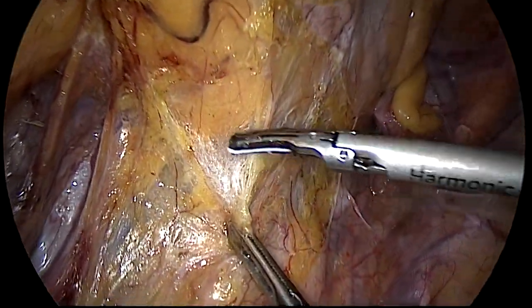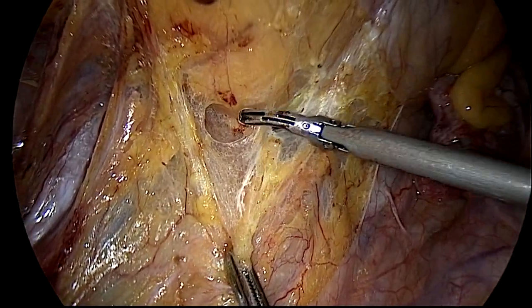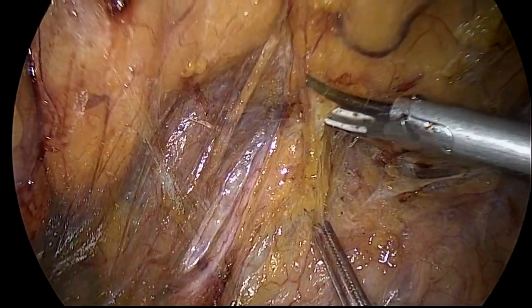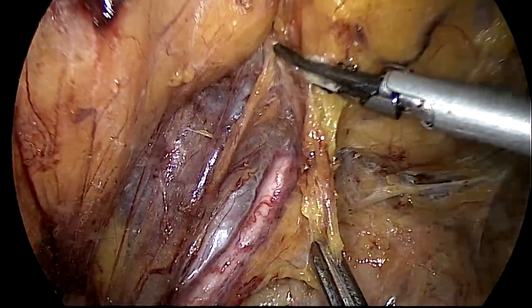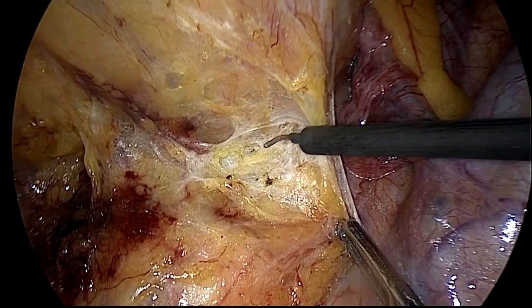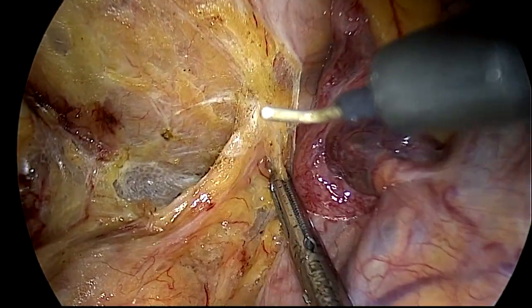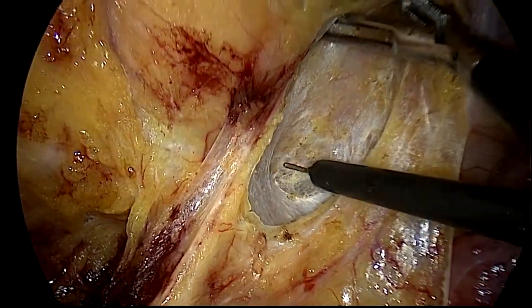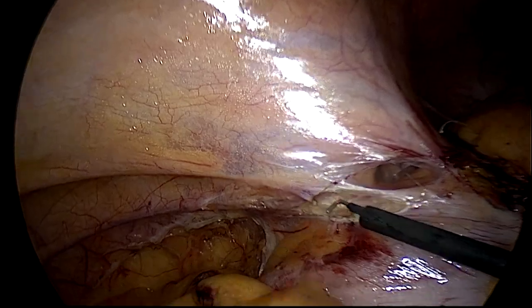Upper rectal mobilization is done to avoid anastomotic tension, especially since we were planning extracorporeal anastomosis for oncological margins as well. One must stay close to the mesorectum and avoid the presacral plane. Please notice how close the left ureter is. The mesorectal plane is being developed and the lateral colonic dissection is performed.